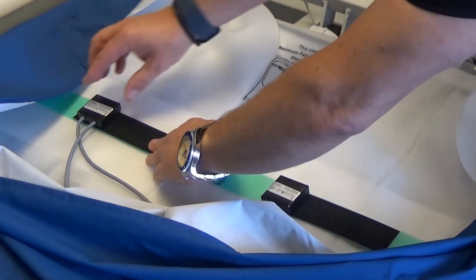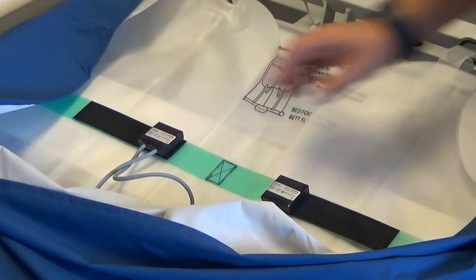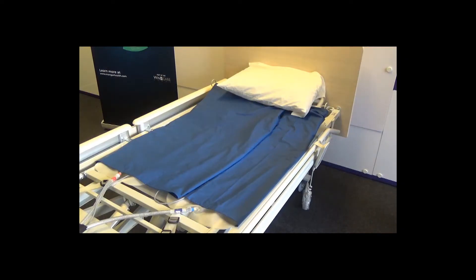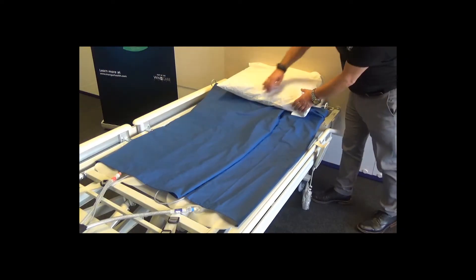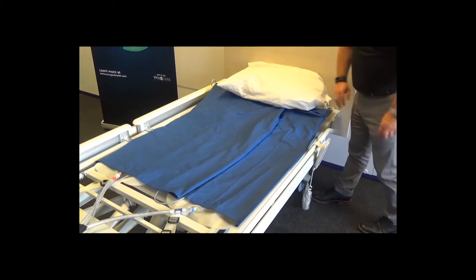To check you have positioned the air chamber system the right way up on the bed, the writing should be visible on the air bladders. It is important the air chamber encapsulates the patient's shoulders, so make sure the top of the system is positioned just under the bottom edge of the pillow.